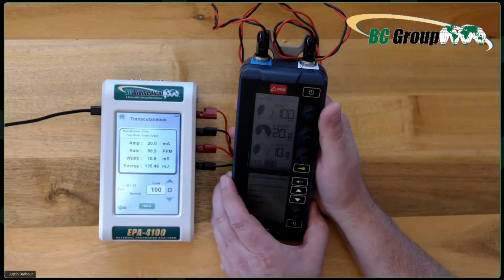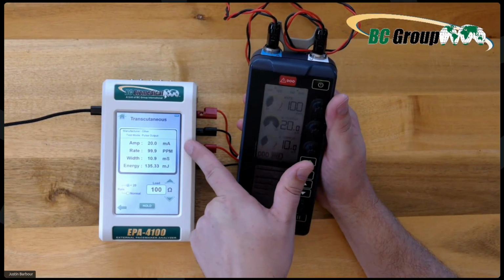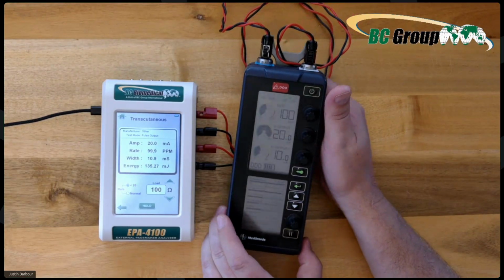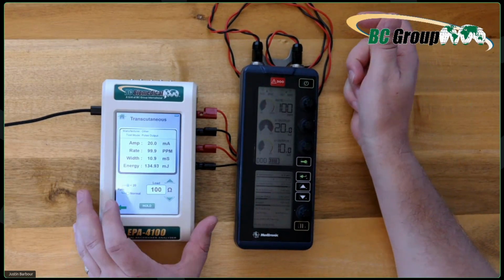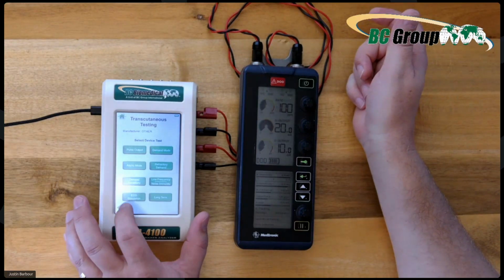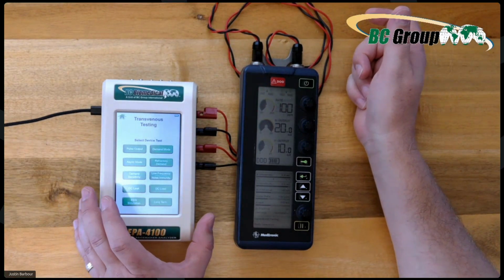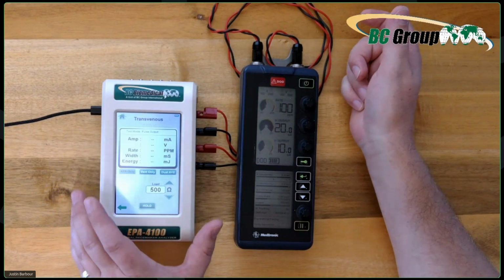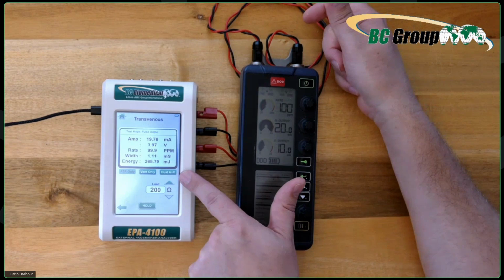So here I have it on 100 ppm and 20 milliamp. We have 100 ppm, 20 milliamp, and that pulse is good. It's very accurate. Now let's go back and start again. Let's go into transvenous and do a pulse output. And with transvenous, we can do the dual A and V.